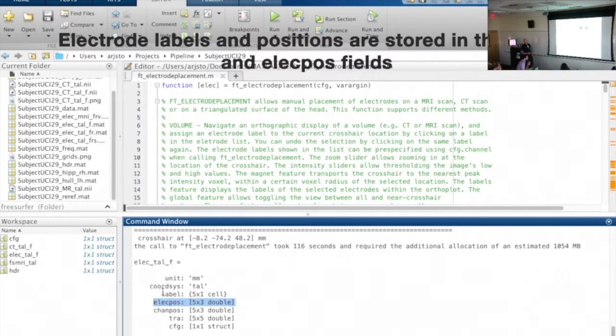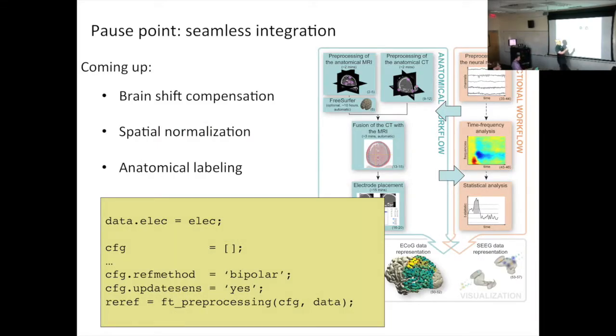This is especially useful if you have oblique grids. If they're not necessarily aligned with the slices here, it's easier if you can click electrodes in there too and then correspond to the label in your list. This is probably the most laborious procedure of the entire pipeline. It takes, I think, on average, 15, 20 minutes. And the output is an electrode structure, which has the labels matched to the anatomical positions. So here the two workflows become already fused. And this is your resulting output. Okay, I already mentioned a few times. So, of course, it's possible to use the recording labels from the header in electrode placement, using the two workflows.